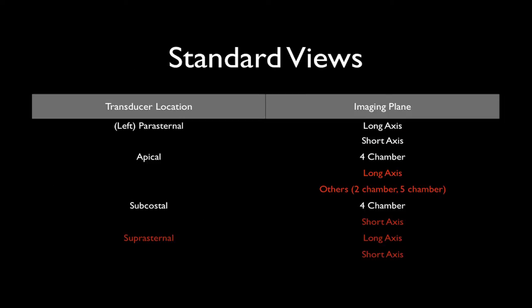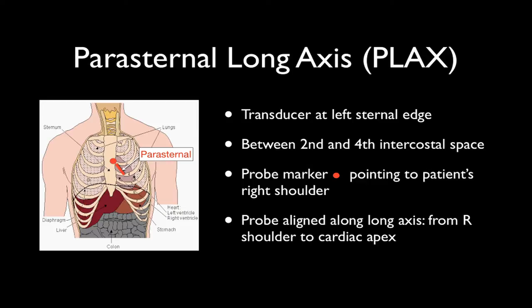This is a listing of some of the standard views — only those shown in white will be described in this course; the rest are beyond the scope. For the parasternal long axis, the transducer is at the left sternal edge, somewhere between the second and the fourth intercostal space, with the probe marker pointing to the patient's right shoulder, aligned along the long axis from the right shoulder to the cardiac apex. Start high up, sweep across, move down an intercostal space, sweep across, move down, sweep across. In performing this zigzag motion, you will find the best imaging position — it is not constant in all people, so you do need to search for it.